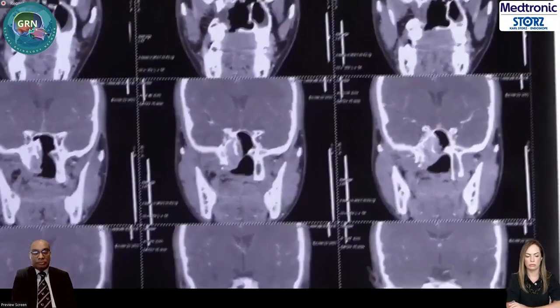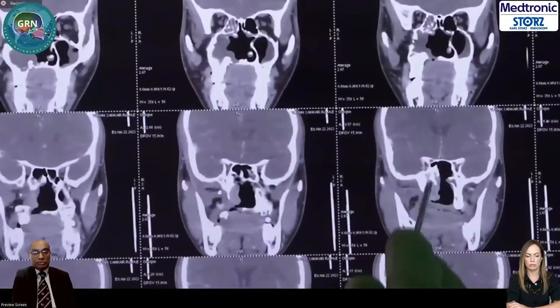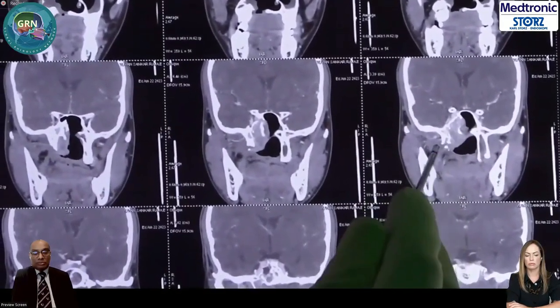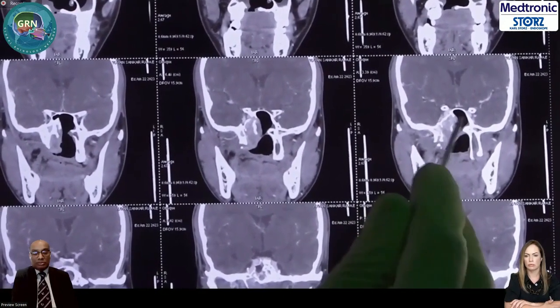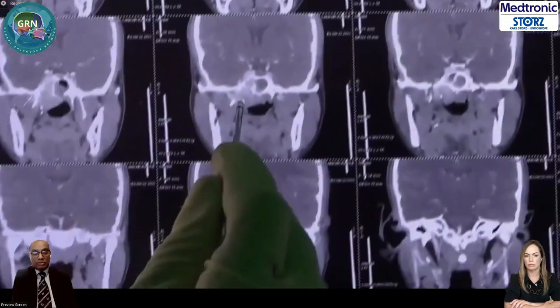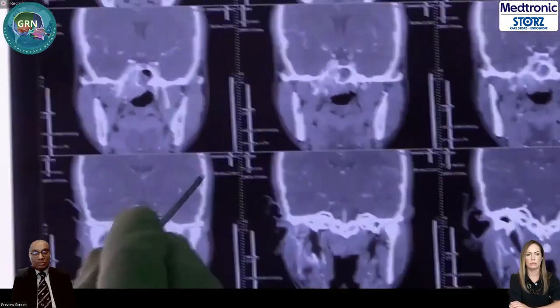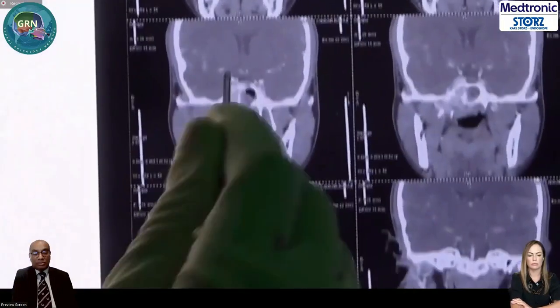Okay, you can see here that this is the lateral pterygoid plate, medial pterygoid plate. This is a transpterygoid space. This tumor is going like that inside the sphenoid sinus. That is the feeder. I coagulated the feeder here, and you could see the tumor. I removed the tumor here. Okay, fine. Now, what I've done is I've removed all this tumor, but this you can see here. Zoom this, please. Zoom nicely.